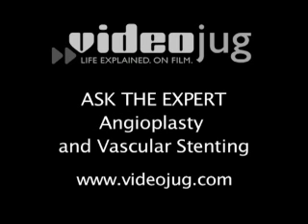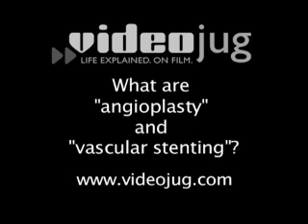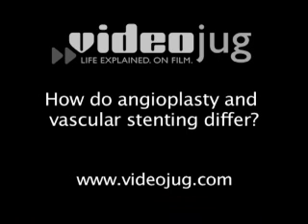Angioplasty and vascular stenting. What are angioplasty and vascular stenting? Angioplasty and vascular stenting are procedures that are performed in order to open up narrowed or closed blood vessels. How do angioplasty and vascular stenting differ?